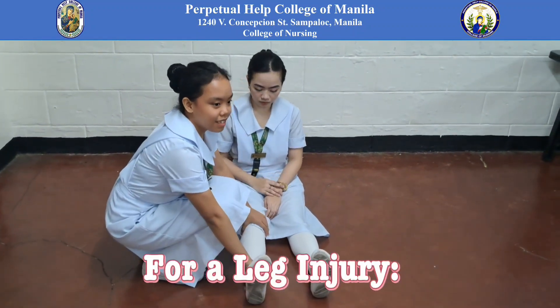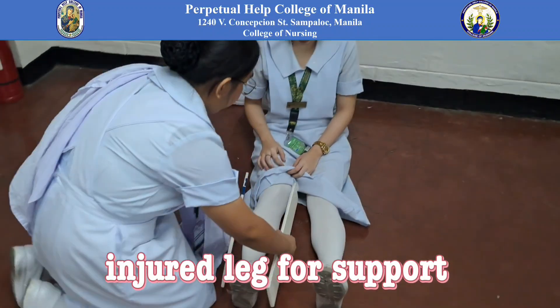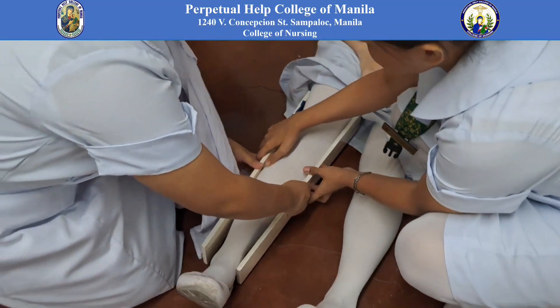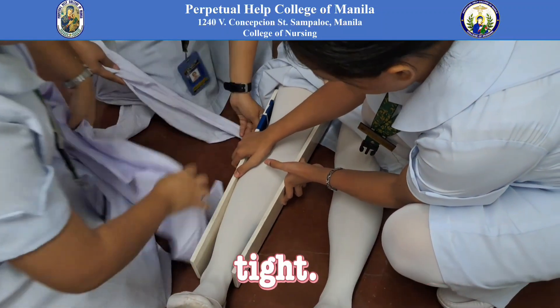For a leg injury, place a splint on both sides of the injured leg for support. Pad around the bony areas to prevent pressure sores. Secure it with bandages, ensuring they are snug but not too tight.